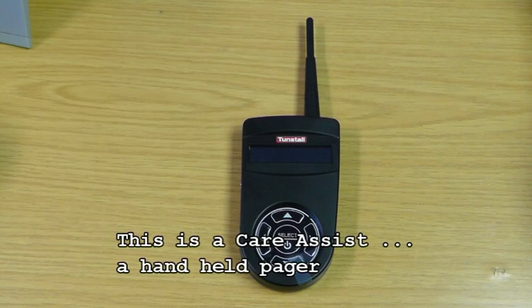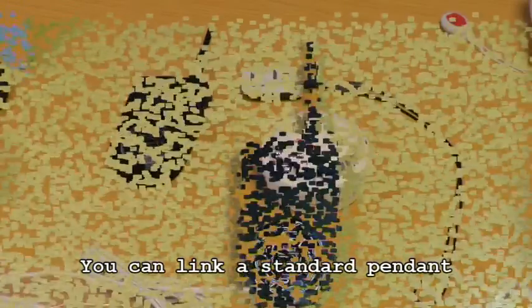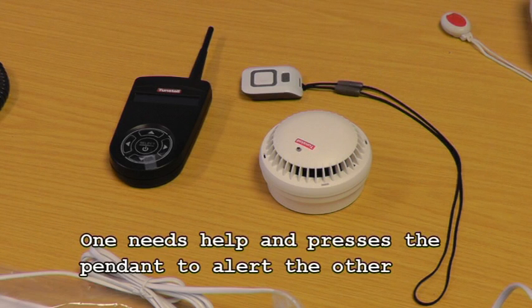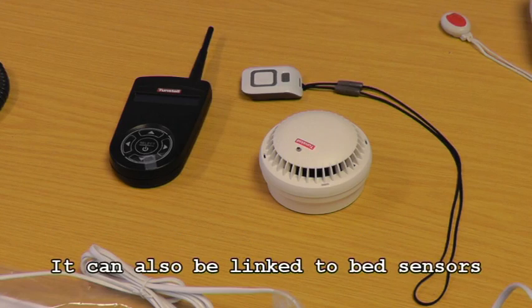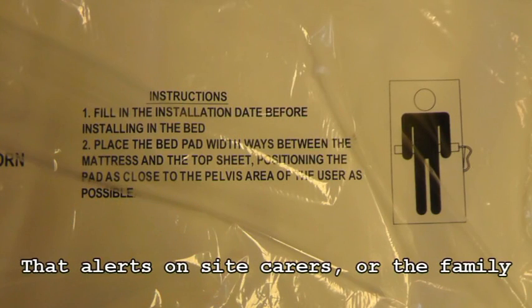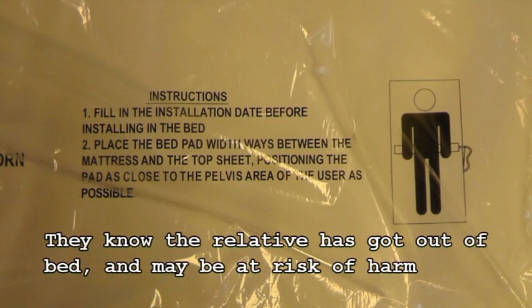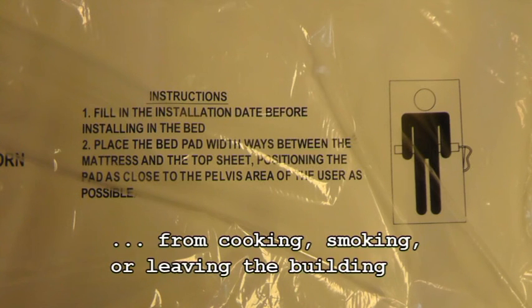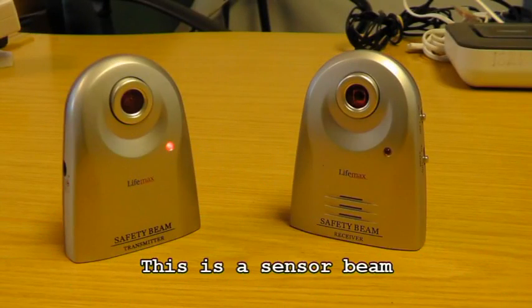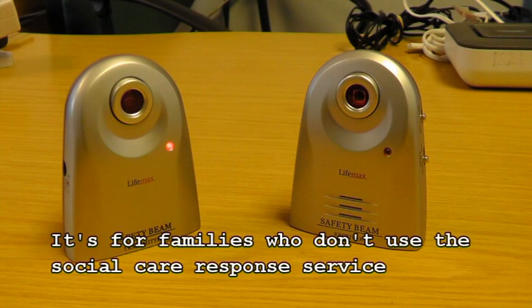This is a care assist. It's basically a handheld pager system. A basic pendant, a standard pendant, could be linked up to it to alert, say you have a service user who lives with their partner, they live in two separate rooms. If one needs assistance, press the pendant. It can also be linked up to bed sensors, which will alert on-site carer or the family that the relative has got out of the bed and may be at risk of harm from putting the cooker on, smoking, or leaving the building.